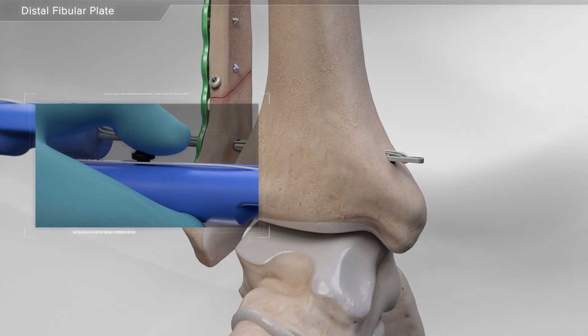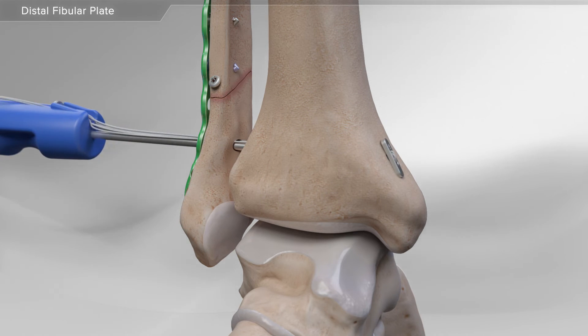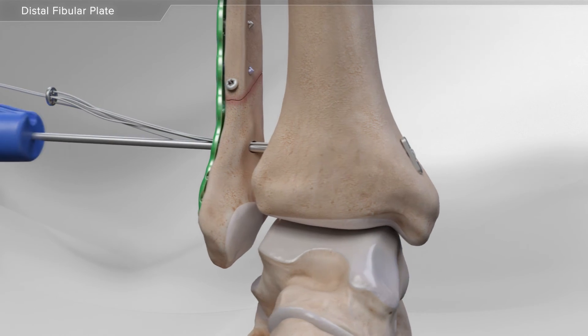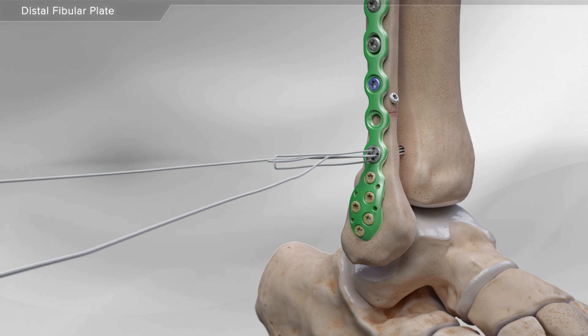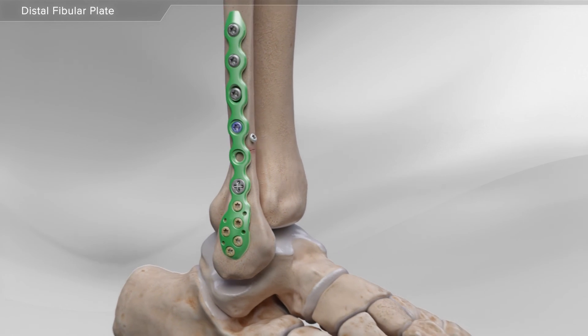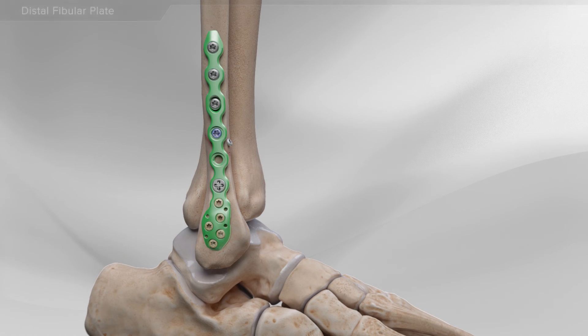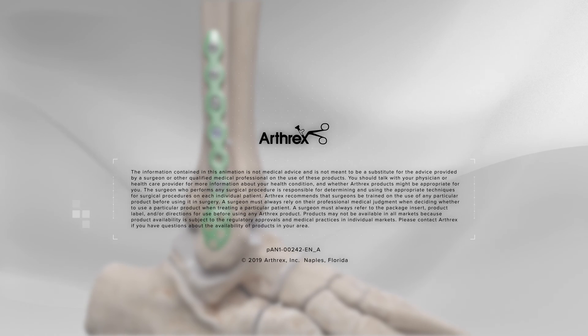your surgeon pulls back on the handle, positioning the button against the bone. Finally, the round button is placed against the plate, and your surgeon pulls on each suture until the desired tension is achieved. This completes the ankle fracture repair.